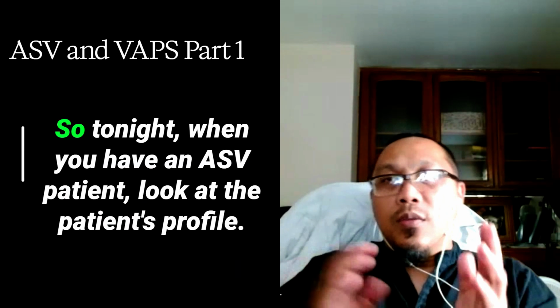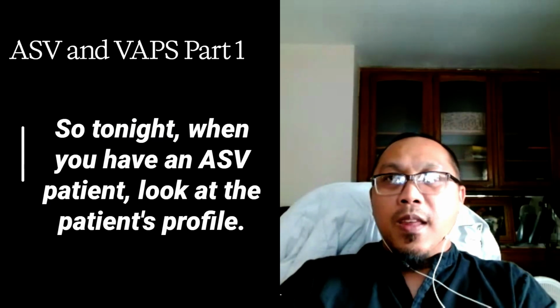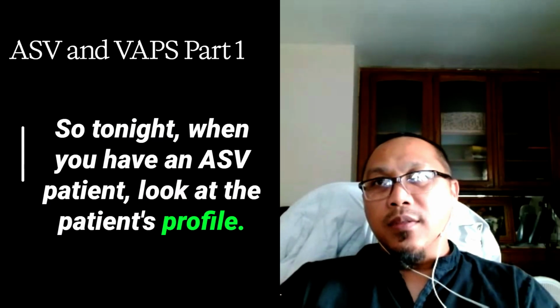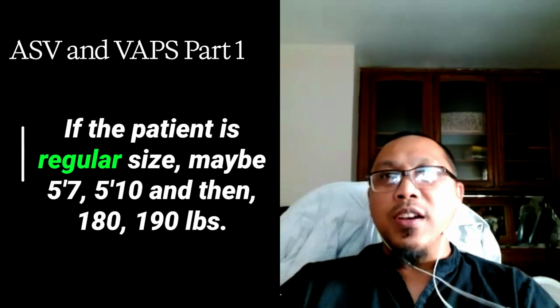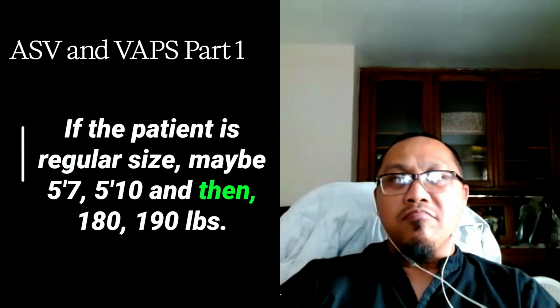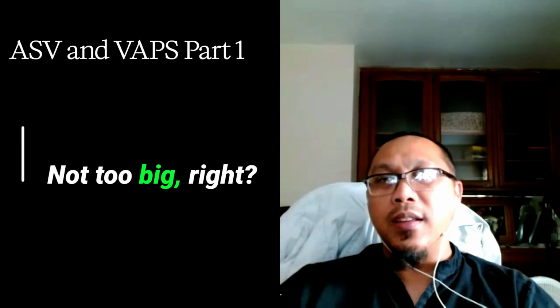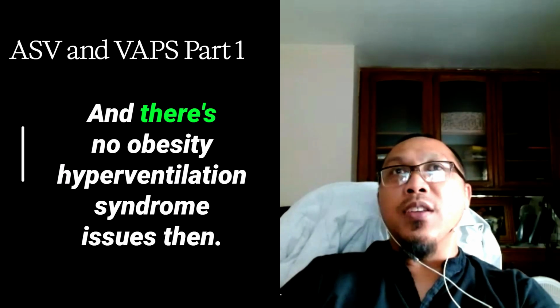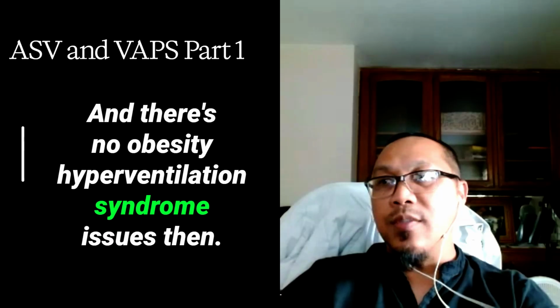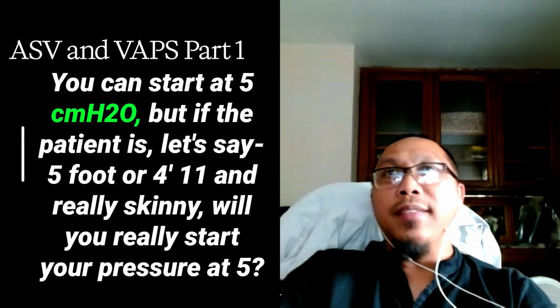Okay? So tonight, when you have an ASV patient, look at the patient's profile. If the patient is regular size, maybe 5'7", 5'10", and then 180, 190 pounds, not too big, right? No OHS, if there's no obesity hypoventilation syndrome issues, then okay, you can start at 5.